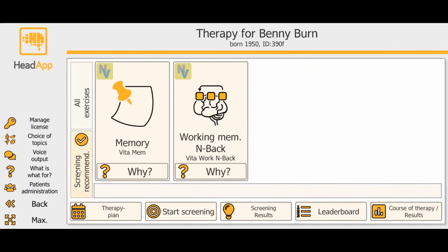Thank you very much. I hope you like the clear structure and the very easy handling of HeadApp.